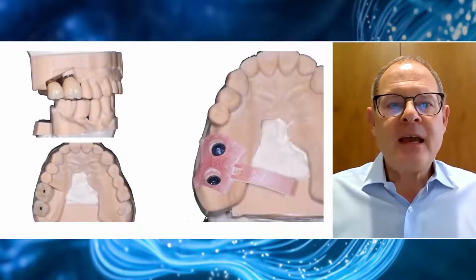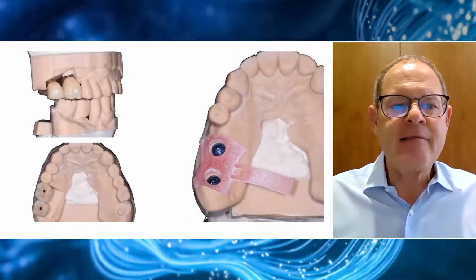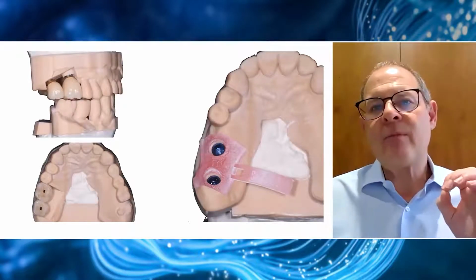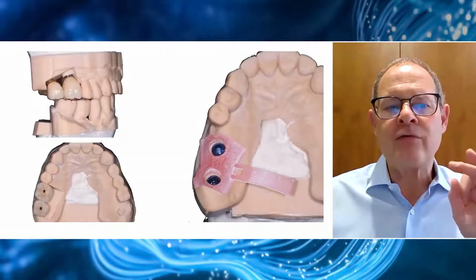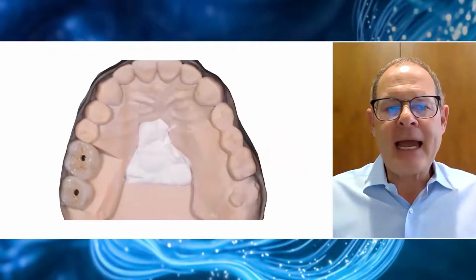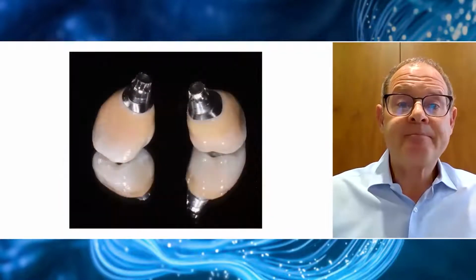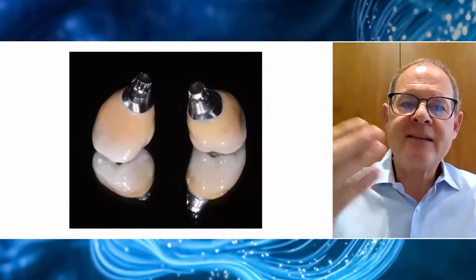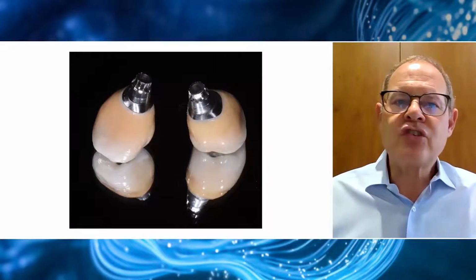And here you can see the two screw retained crowns placed in a protected occlusion, so there's slight clearance. And if we use the Atlantis reangulating screws, they happen to come with quite small screw heads. And so we can get very small holes through the ceramic or through the zirconia that we have here, which means they're very easy to mask. And to be honest, you wouldn't really know that there were any screw holes there. The transition zone from abutment to zirconia and layered porcelains, as you see here, is really very fine. And this means minimal irritation to the soft tissues.